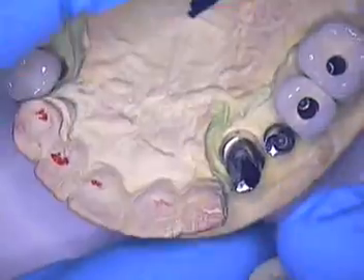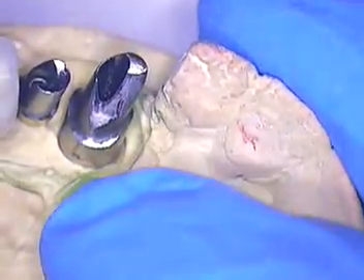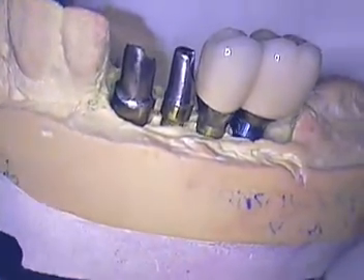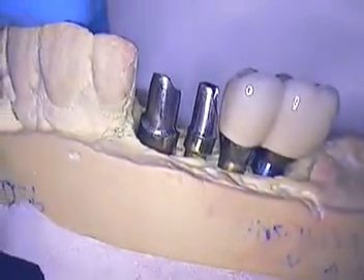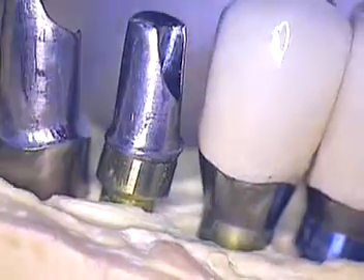A little bit about the lab work and the metal work — this was designed on the computer to show you the long, almost six-millimeter length. The abutment design for the cuspid — you can see how long that is, it just goes way below. The crest of the tissue is right out where the margin is. Look at the difference between number six and number five — huge difference there. You can see the complexity in this case.